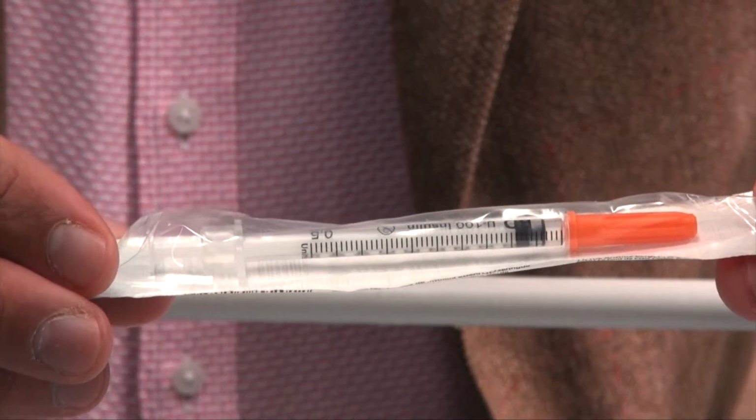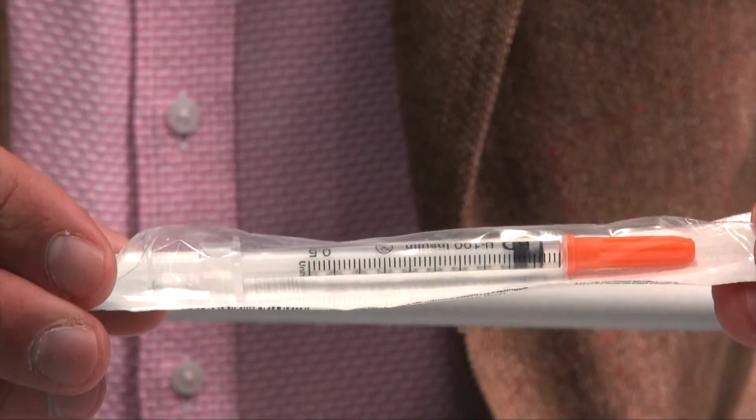It has a very small amount that can be injected, and it is only useful really for very small, precise injections, as the distance between the markers is larger. So I'm going to start by showing you the 0.5 and 1 ml versions.